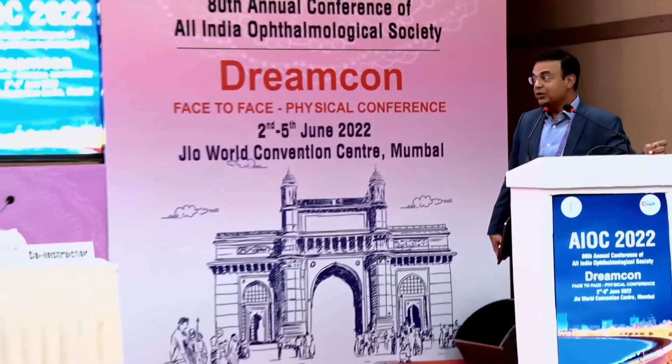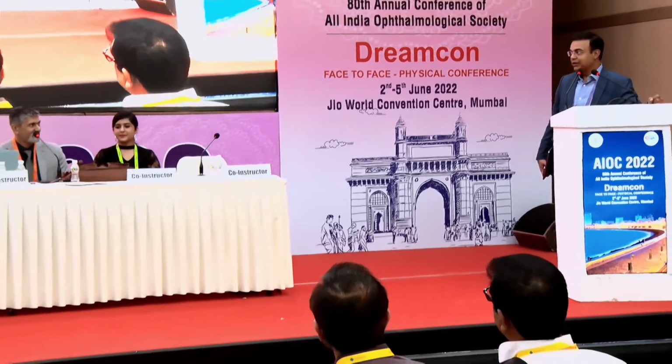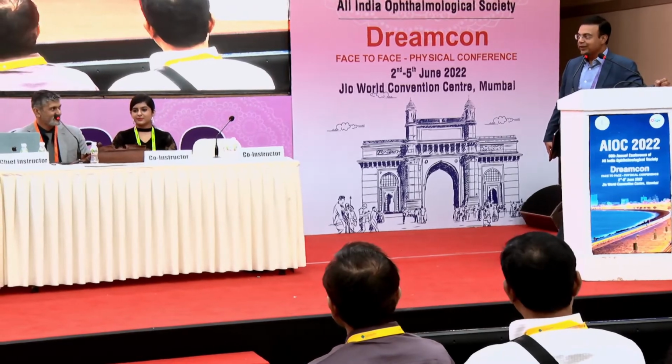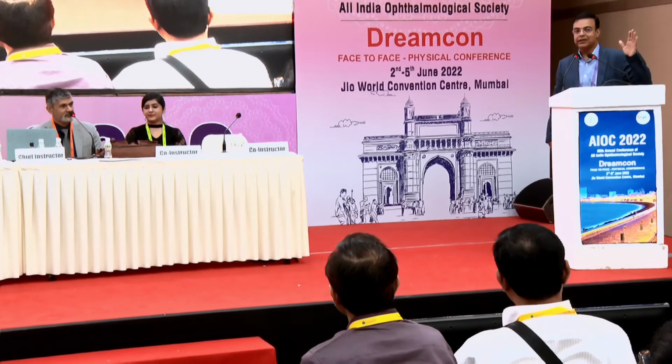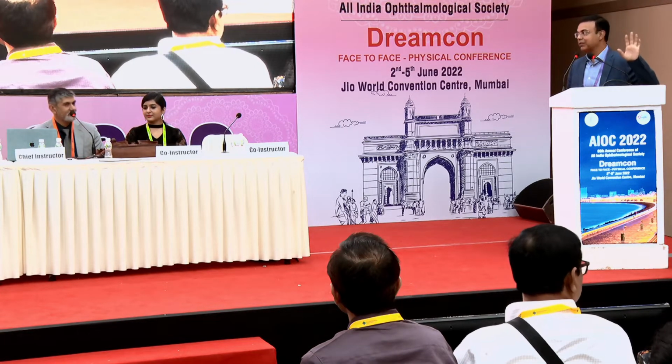And I also have done quite a few torics now with our post-RKs, which initially I used to totally avoid, but it seems to be working really well, again using the Pentacam. If it has different optical zones showing consistency in the axis and the magnitude of astigmatism, you can still go for it, looking at the maps and trying to pick up those cases where it will work. So it has been very gratifying for some of my patients.